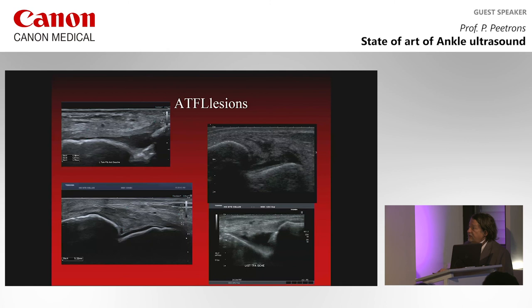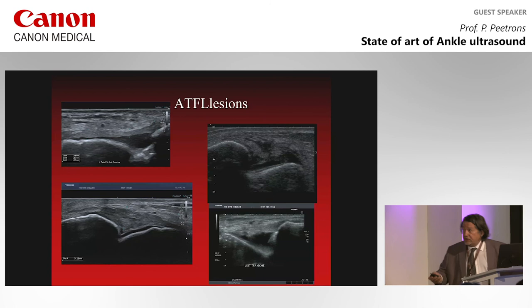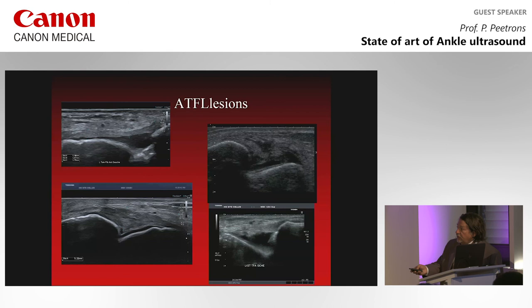can give you an image of a thickened ATFL. So this can be a reason why you have instability of the ankle, and we'll see how to look for instability in a few moments. And this can be a reason why you have still pain in the ankle when you do an eversion. So in eversion, you are just putting together your talus and your fibula, and of course this is a part of the ligament which is much thicker than normal, which can be very painful when the fibula is going towards the talus in eversion.